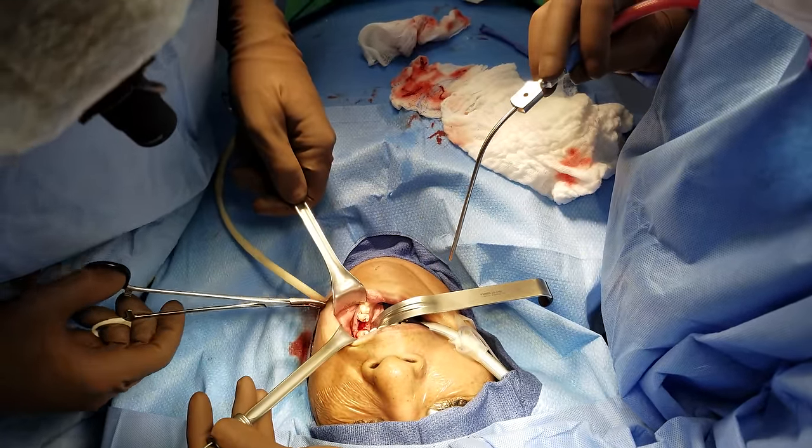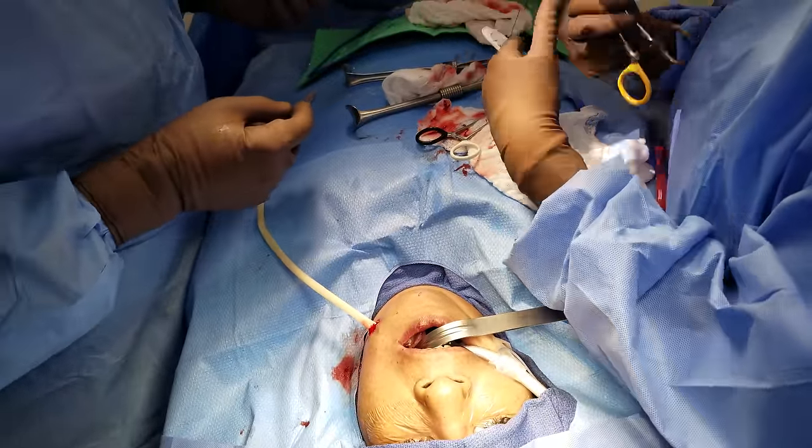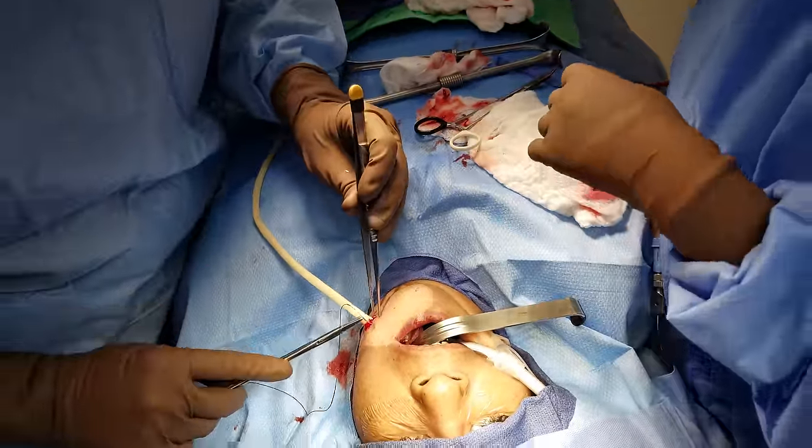Okay. Can we get the silk suture first, please? That'll be a drain stitch on the outside. If you want to, you're going to hold that up, make it easier for us. Appreciate it.